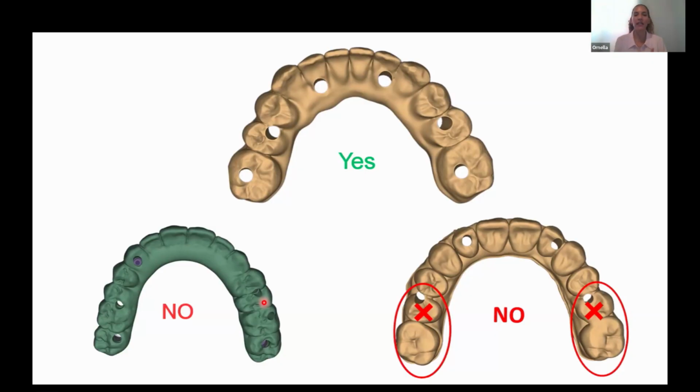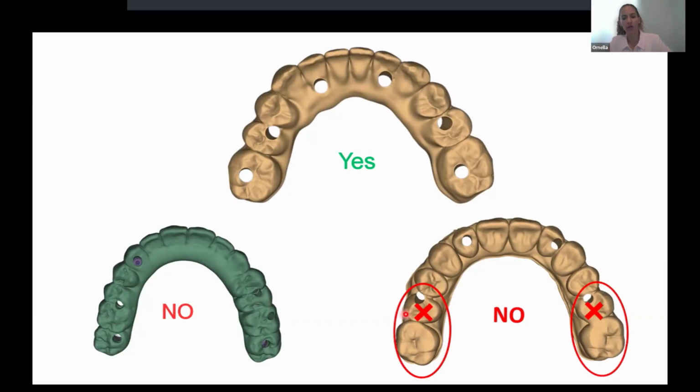What we are doing here is reinforcing the structure in the bottom, and then we put a material that is going to give us the same advantage of the graphene technology, okay? We are going to have absorption of loads, we are going to have aesthetics, we are going to have a lighter structure, etc., okay? Now we go with the all-on-4, okay?